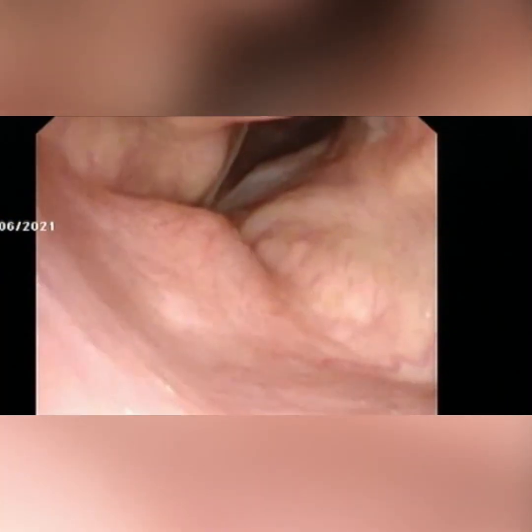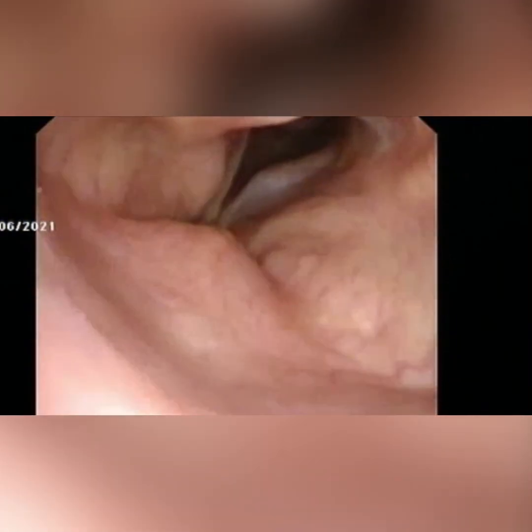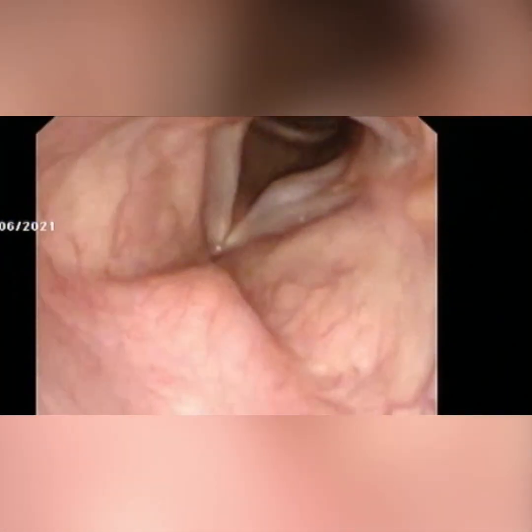When the needle is exactly in position, we start injecting the material — hyaluronic acid in this case. We see the ballooning of the vocal fold due to injection into the paraglottic space. We ask the patient to phonate and always tend to over-inject slightly, as we know these are temporary materials.